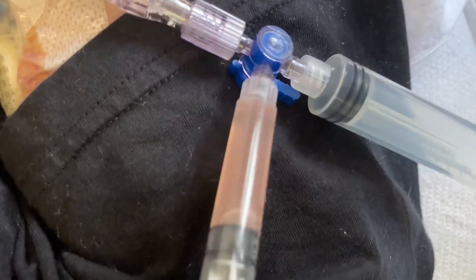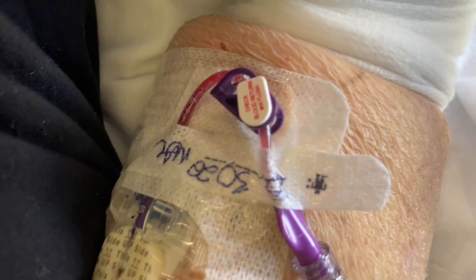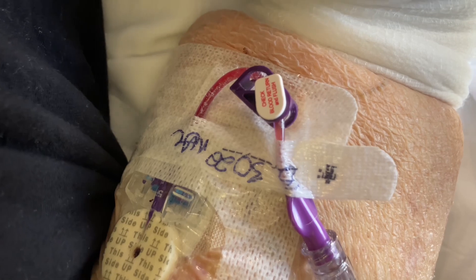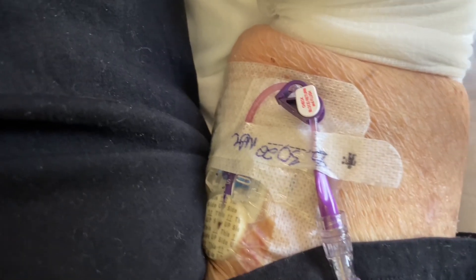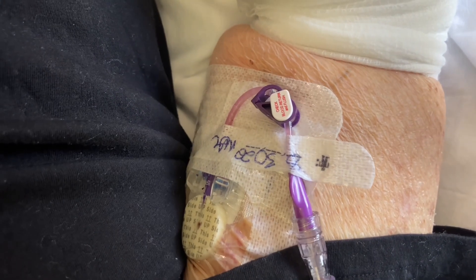You can definitely see it. So we're going to keep doing that — let it agitate inside the blood so it can exchange broken down clots for the cath flow. Just a couple of pumps here and there, and not even 10 minutes in — look at that.